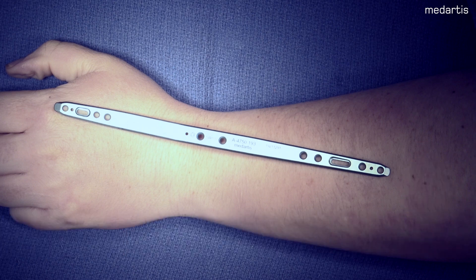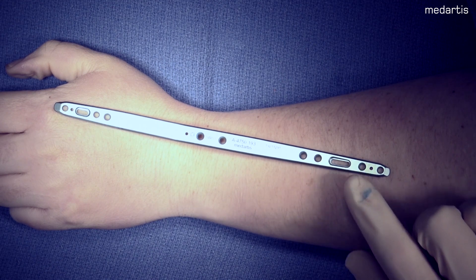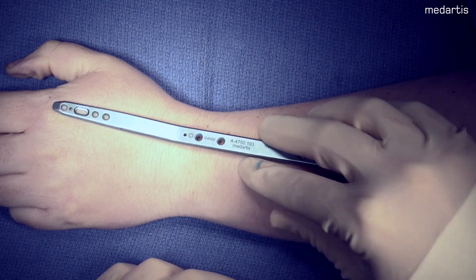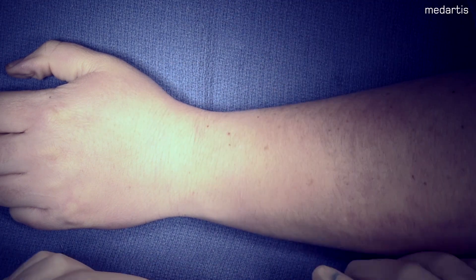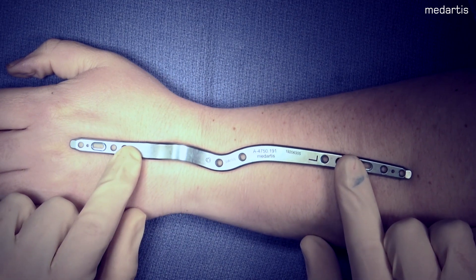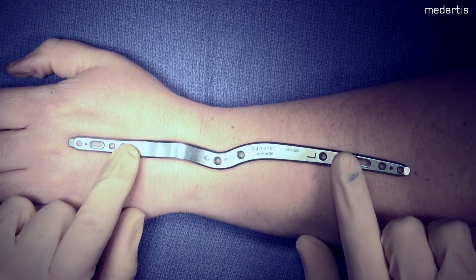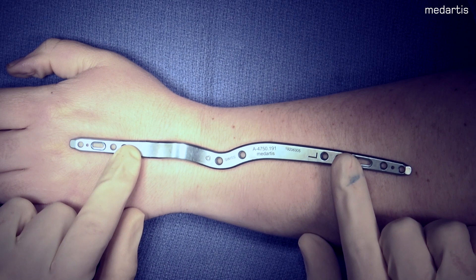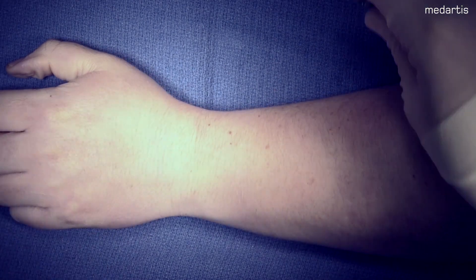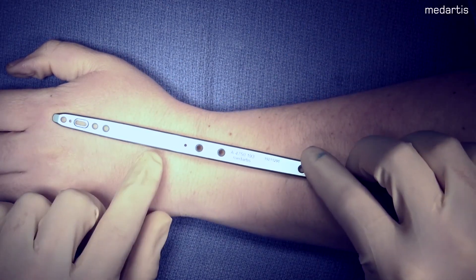Currently MedArtist has two options for dorsal spanning plate. First, you have the straight dorsal plate designed to be off of the second metacarpal. The next is a curved plate designed to be off the third metacarpal. I choose the curved plate whenever it's a fracture dislocation type where I want to be on the central axis of the radius and the carpus. I choose the second metacarpal straight spanning plate whenever it's a purely comminuted radial column fracture. Today we will be discussing the straight plate.